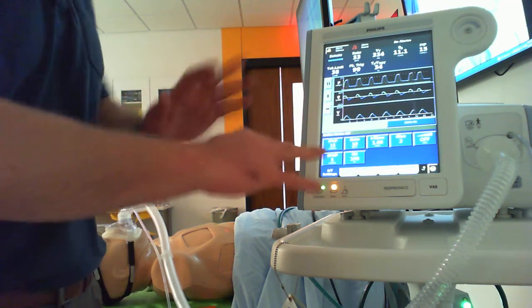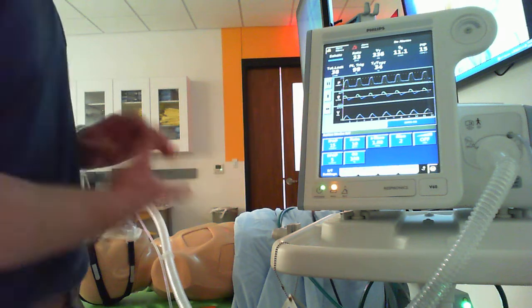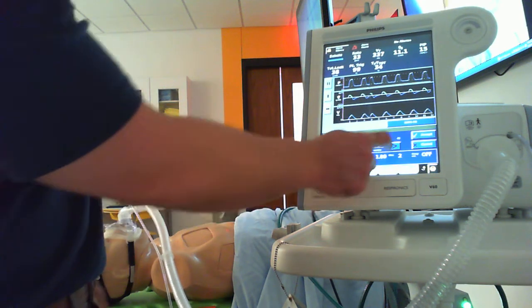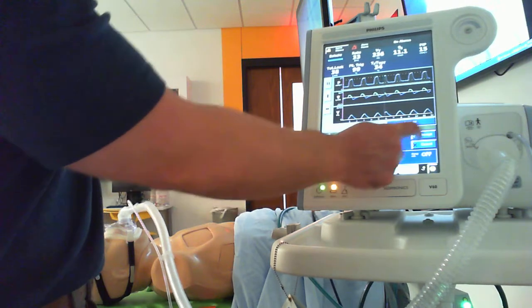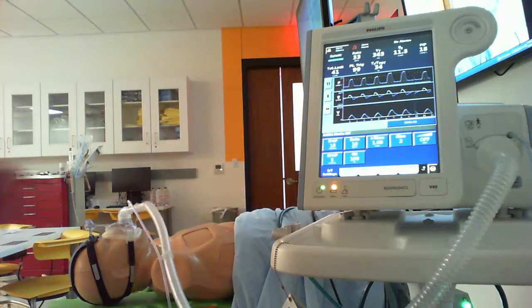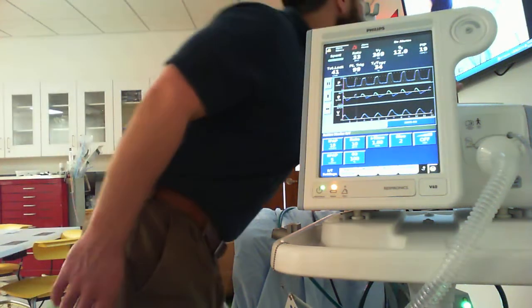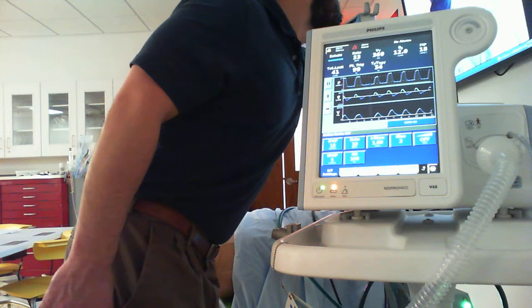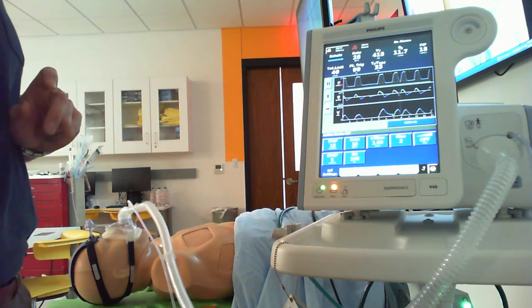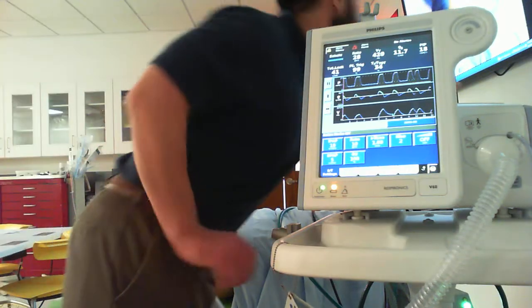The I time has nothing to do with any of the breaths this patient is currently getting for the most part, okay? I'm gonna go up a little bit more. So usually going up by 2 or 3, asking the patient if that feels better. Don't forget about the patient here. I'm giving you a little bit more help here, buddy. Okay, as that tidal volume improves, we would expect to see that patient's respiratory rate improve. Once again, watching the leak.